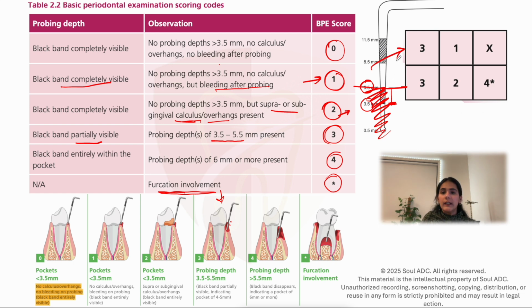Now, when you have put it into this box, this is like a standard thing that you'll have with you. Whenever you refer the patient to someone, you will send the same box with you. And as in, if I've referred my patient to someone else, I can always see what is going on, what is the issue, and I can treat based on that. Okay, so these are the scores that we give.